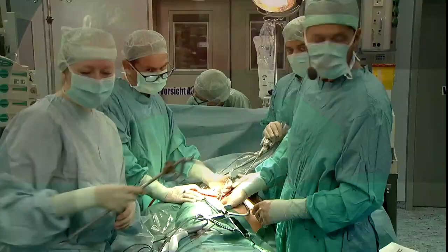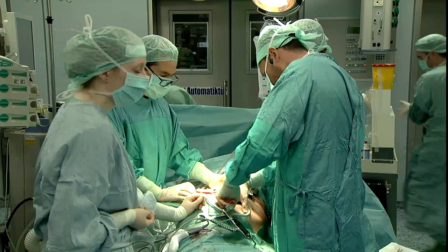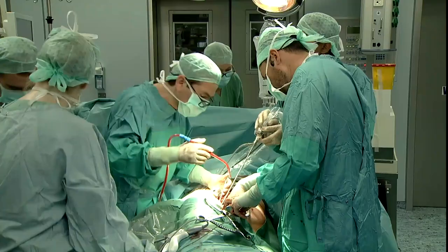Okay, if you help me with a valva... We need some help with the retraction and then we will finally... Because we are right at the bladder, but there's a vessel in there that is killing me. And there's no way that with this retraction I can get to it. Because I'm at the pubis bone here, so there's no way I can get deeper. And she looks thin, but she's very deep.